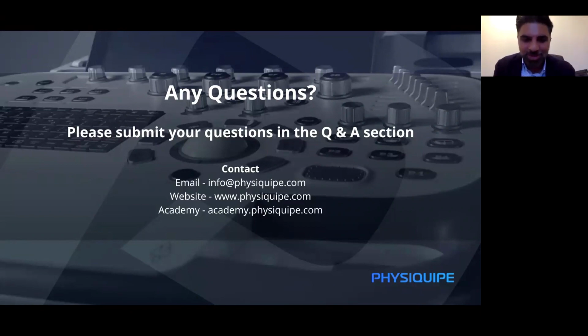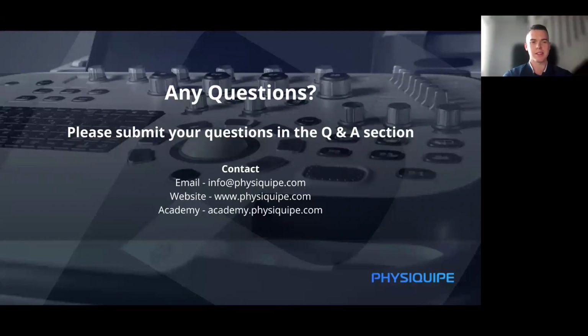Because one of the other things about ultrasound is that if someone goes on to treatment in the community with steroids, etc., it can alter what we're seeing on ultrasound, and it doesn't give us an accurate picture as well. So normally, we still manage to see these patients within a few weeks. Okay, yeah, that's interesting to hear. And that's pretty good in the current climate, as you touched on, I think.